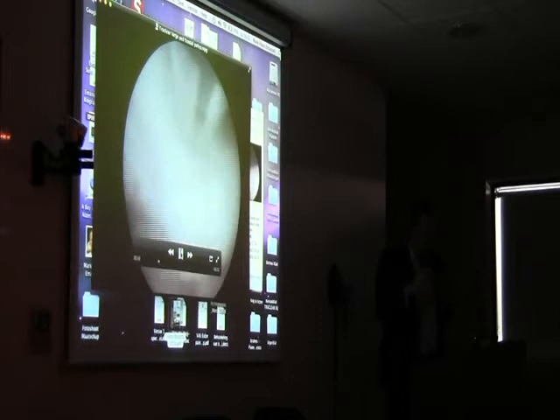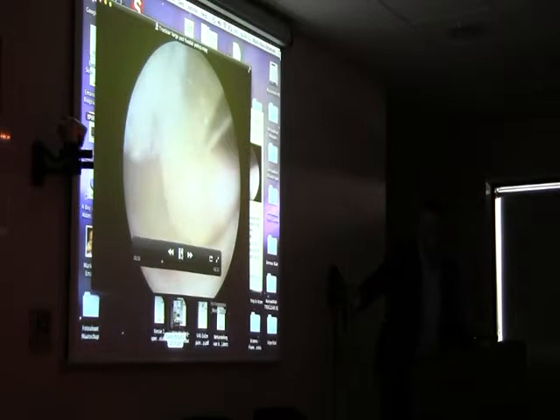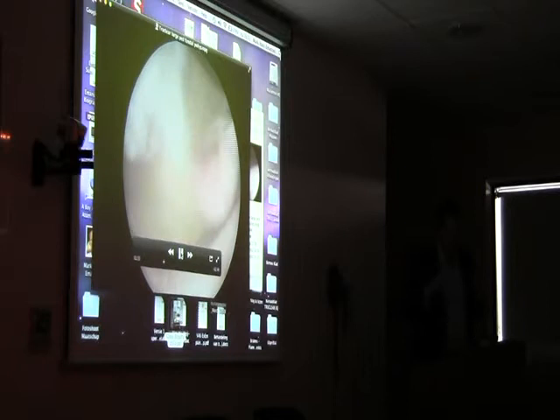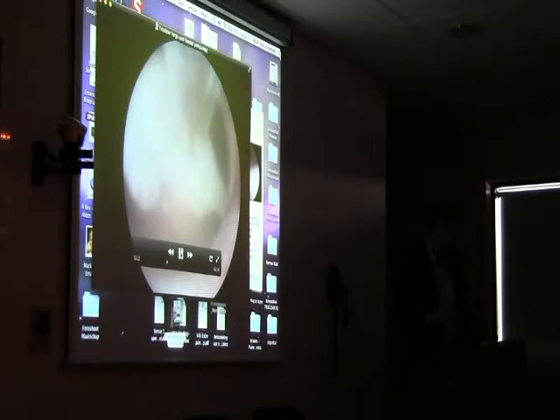Particularly towards the end, as it disappears, you have to remember to follow it. And this is all in real time, because I'm not a man of editing things, but I'll fast forward it. In total it's a 3-minute video, and this is in the outpatient. So this is a big polyp, and you see how quickly it chews it away, and you start to see the cornual recesses at the top now. That's what I say, the polyp dances, you just hold it there and you suck, and off you go.